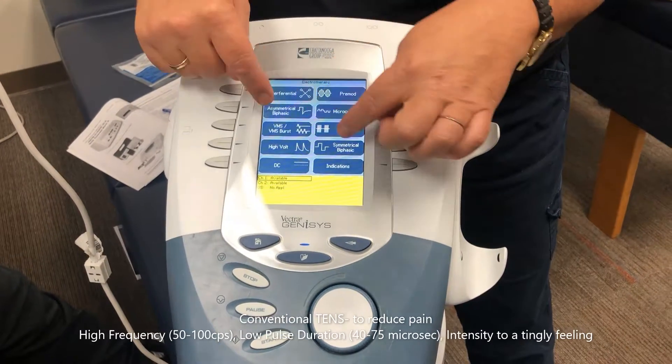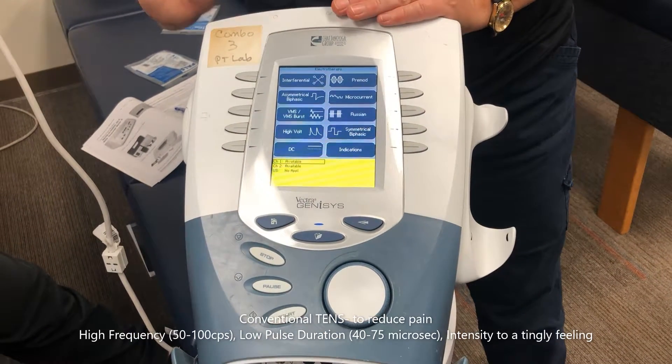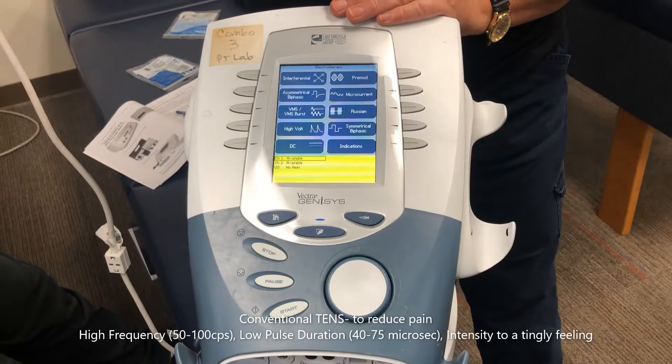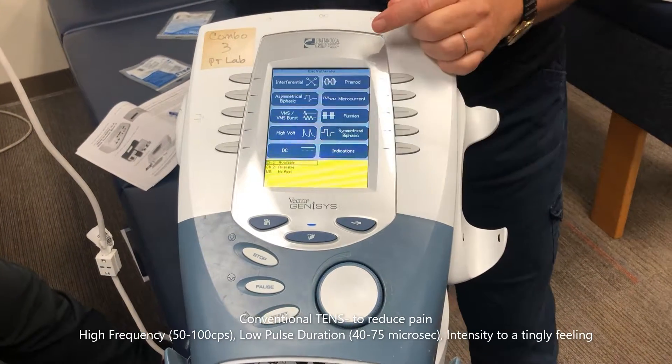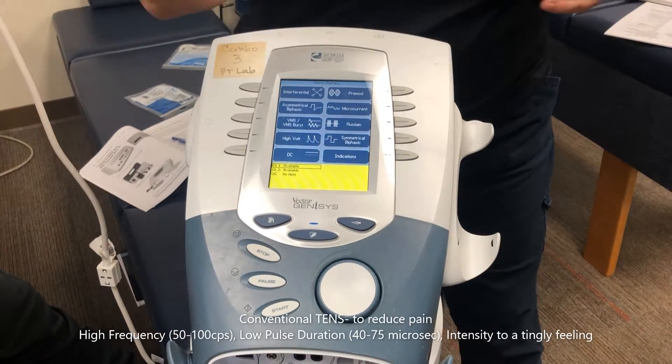When I compared them, I found asymmetrical more comfortable. It kind of ramps up gradually — 'I'm turning on, now I'm on' — versus symmetrical which is just 'on, off, on, off.' I prefer the nice swooping gentleness of the asymmetrical.